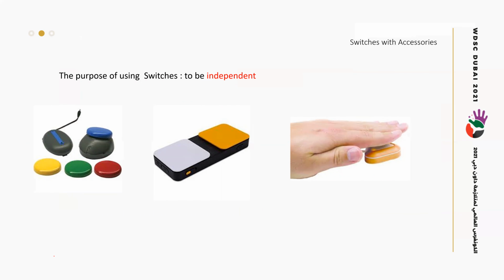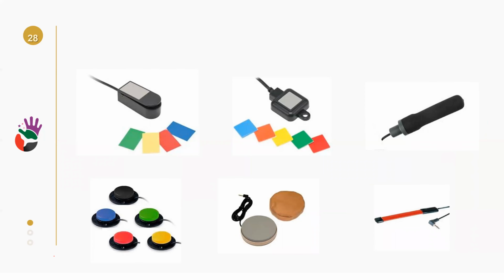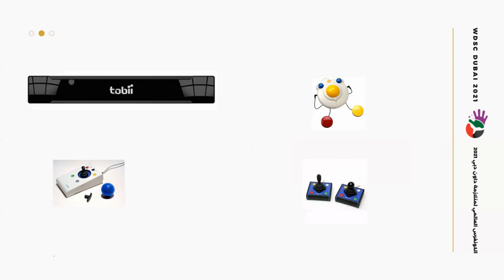And there are accessories to add to the computer. As we mentioned before, if the child has hypotonia and affected fine motor skills, we can add assistive technology or switches to the computer so he can use it in an easier way.